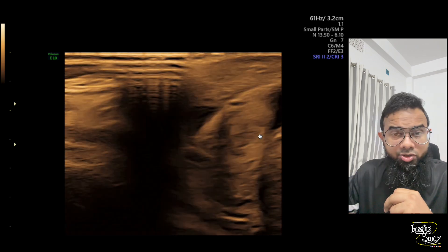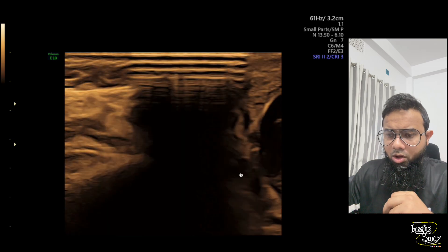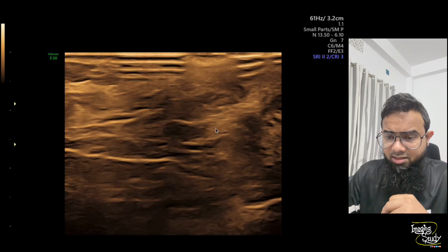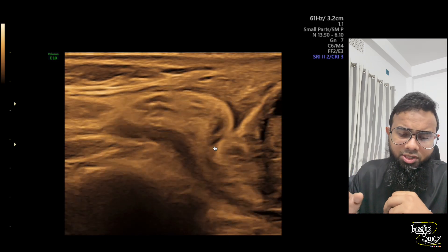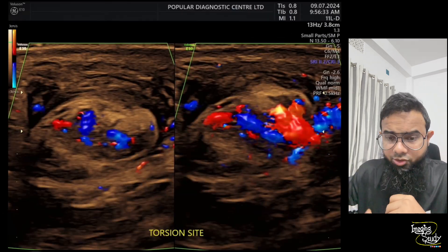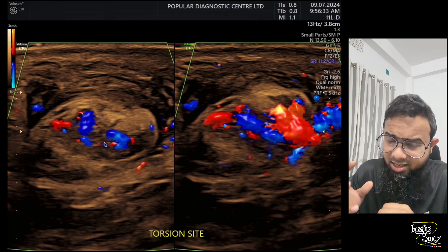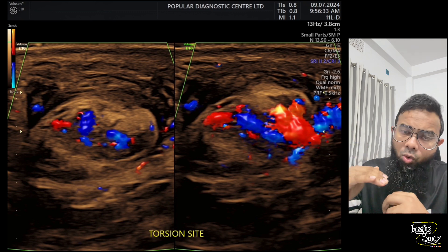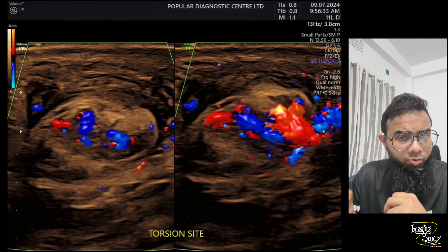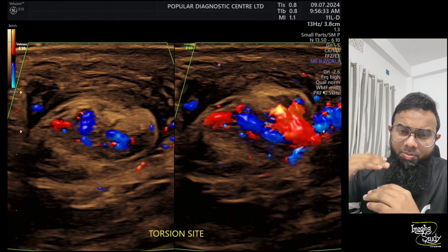Here is another view in longitudinal section where you can see the cord is getting bulged — this is the site of torsion. On color Doppler in cross-section, you can easily identify the torsion site. The cord shows vascularity up to this point, but below that there is no flow within the testes or epididymis. This torsion site is located at the upper part of the testes at the cord level.